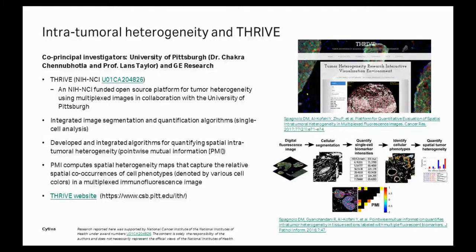We continue some of our work in colorectal cancer. We're able to carry some of these data sets through. We have shown in this web-based analysis that we can conduct both very simple single cell analysis, as well as the metrics for quantifying heterogeneity. And both these works are published, and we continue to have a very good relationship with the University of Pittsburgh and that team.